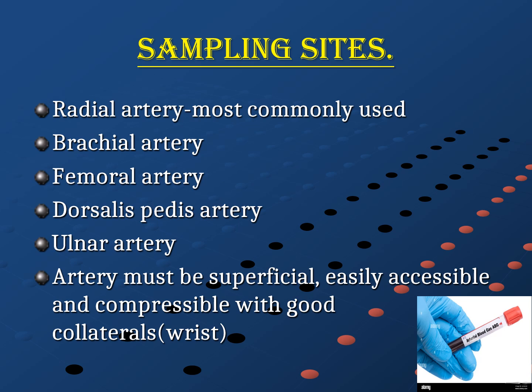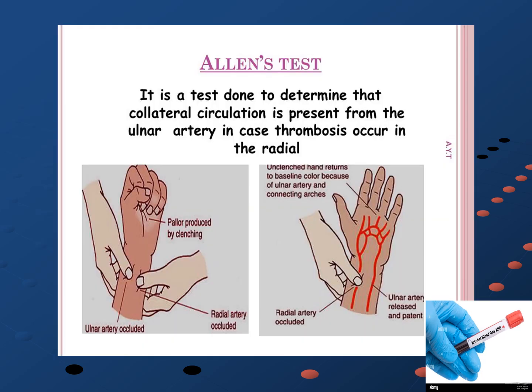The Allen test is a simple medical test that 1. Checks blood flow to the hand. 2. Evaluates the radial and ulnar arteries. 3. Ensures it's safe to draw blood from the radial artery. The test is done by compressing both arteries, releasing one artery, checking hand color, and repeating with the other artery. The test helps determine if it's safe to draw blood from the radial artery and avoids potential complications.